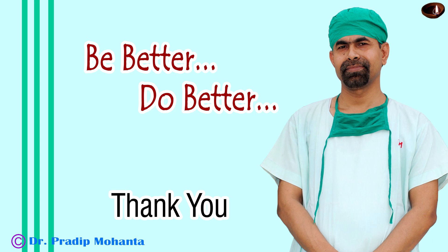Thank you very, very much for your attention. Hope this video will help you in developing your surgical skills. In such cases, if you are confident enough, you can do single-handed phaco to avoid injury to the iris.